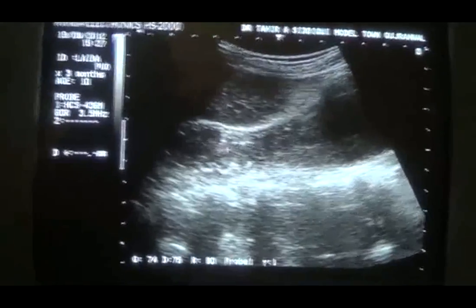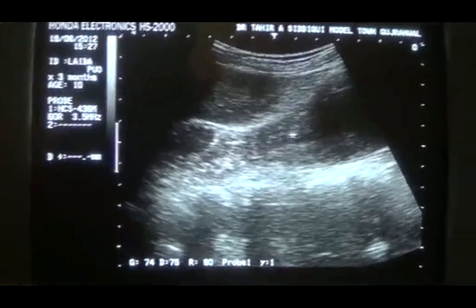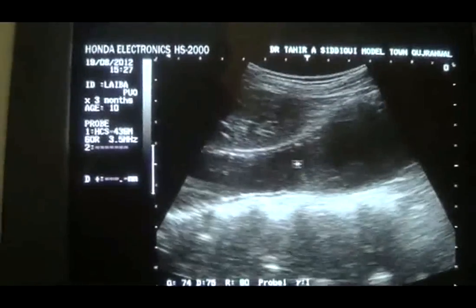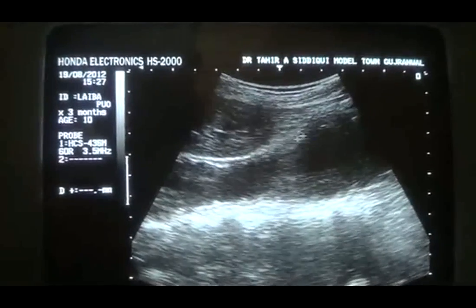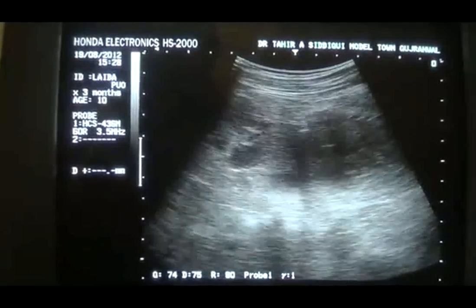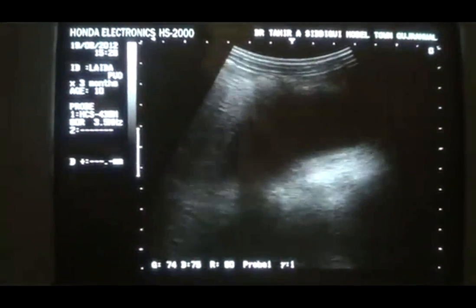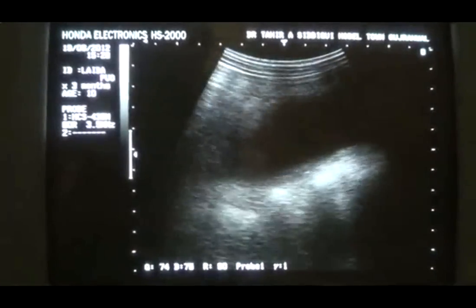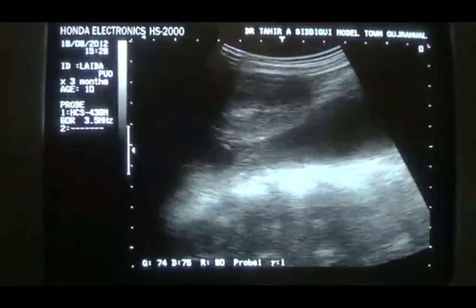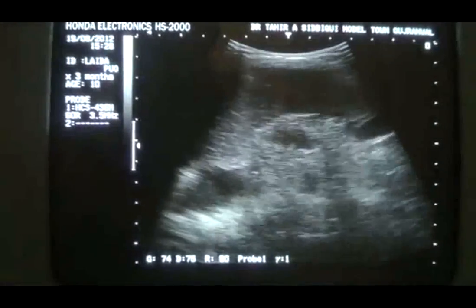Otherwise, the abscess gives the appearance of this area. As you are seeing in this region, the abscess pocket usually gives the sonographic appearance consistent with this. Now it's clear, having echogenicities at the margins, the major portion being clear internally because of the sterility produced by the many antibiotics used by this young girl for the last 3 months.